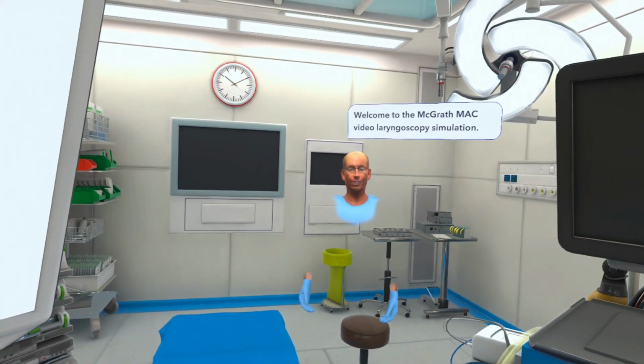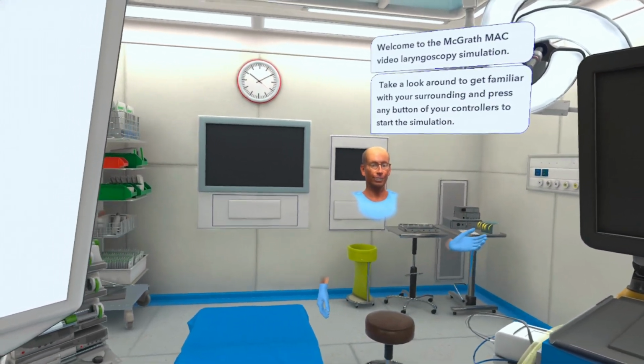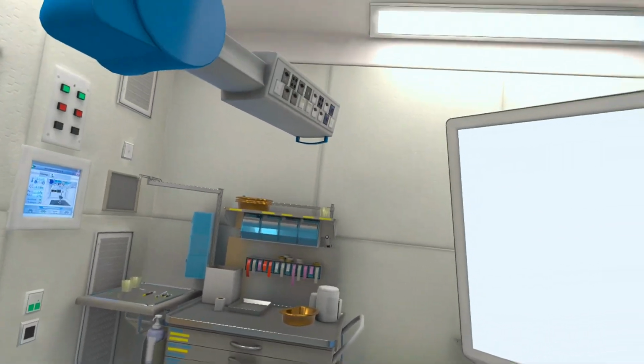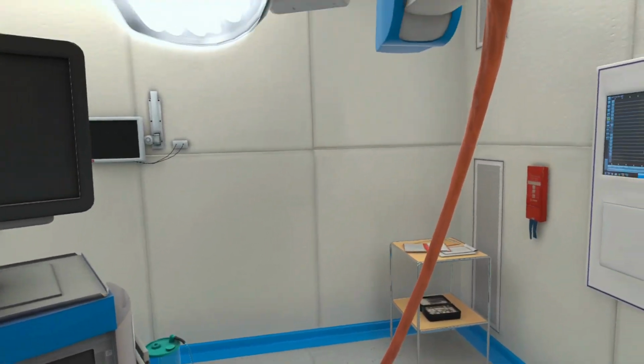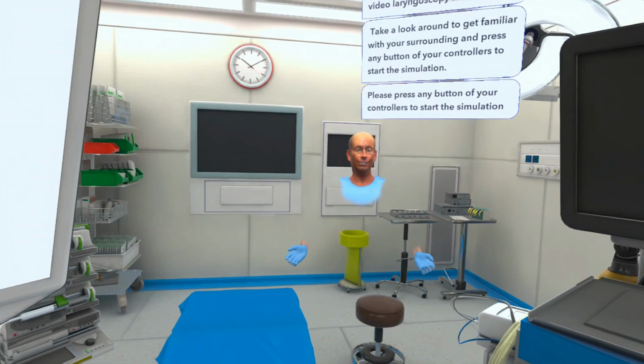Welcome to the McGrath video laryngoscopy simulation. Take a look around to get familiar with your surroundings and press any button of your controllers to start the simulation. Please press any button of your controllers to start the simulation.